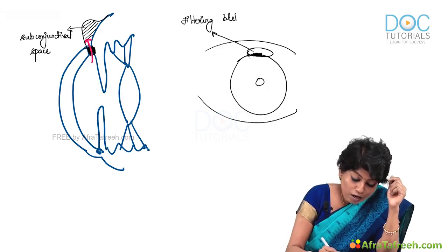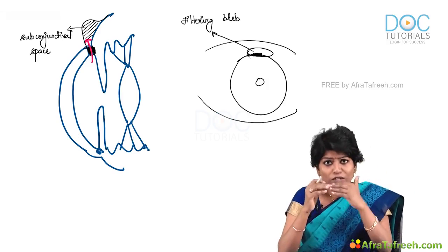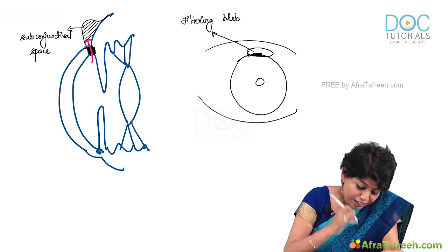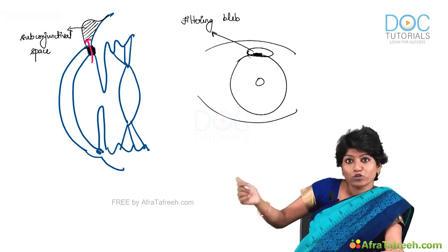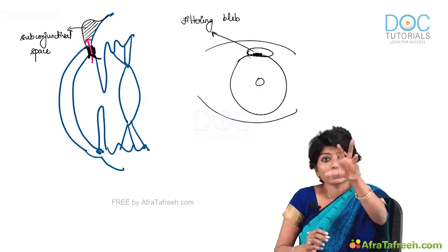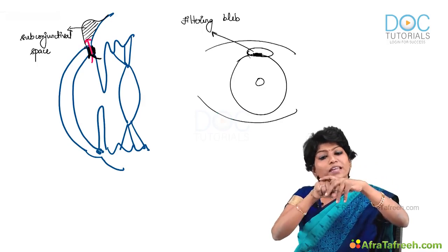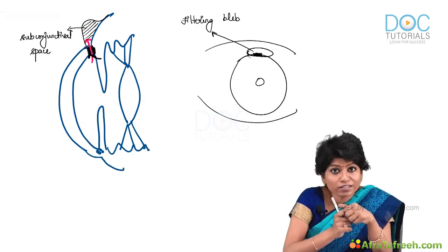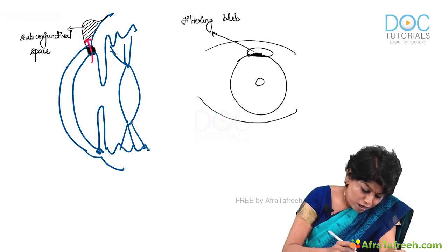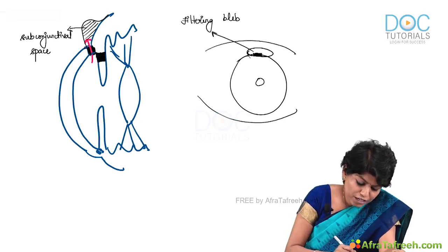Alright. Now, why is a peripheral iridectomy being performed? Exactly overlying where I am removing the trabecular meshwork, we are going to do a peripheral iridectomy. Why? Now, supposing I do not do it, look at the cross sectional picture. The iris can move forward and block that opening. So, I have an opening here. This iris can just go in and block that opening. Then the whole purpose of doing a trabeculectomy is lost. So, what I do is remove a small bit of the iris there.